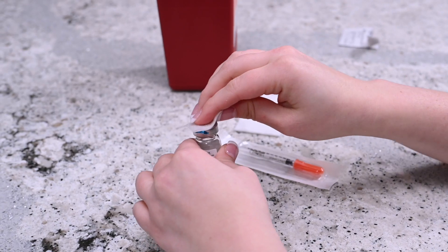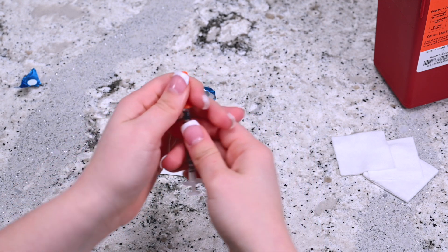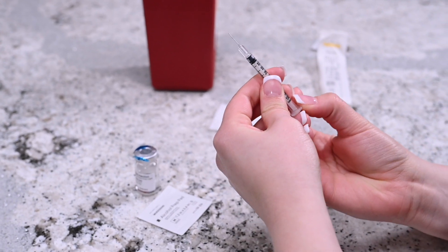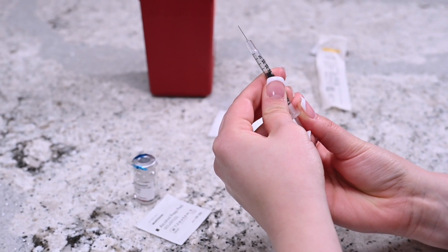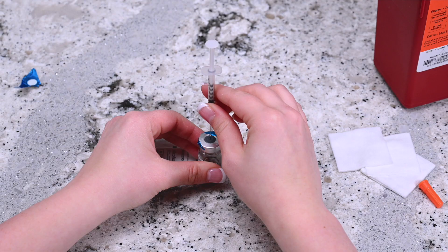Remove the needle and syringe from its packaging and remove the cap. Hold the syringe upright and draw in the same amount of air as the dosage required. Insert the needle into the vial of low-dose HCG and push the plunger until all of the air is inside the vial.